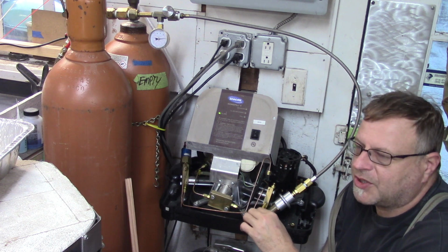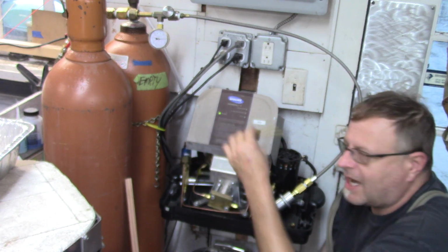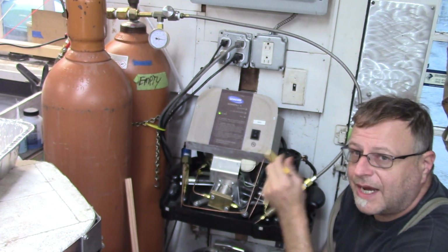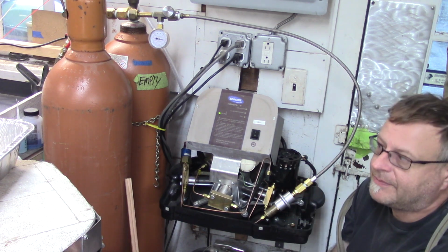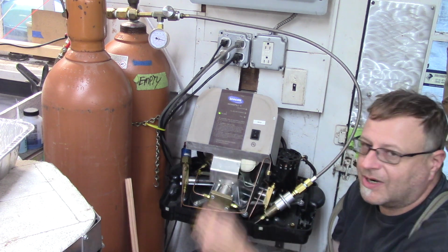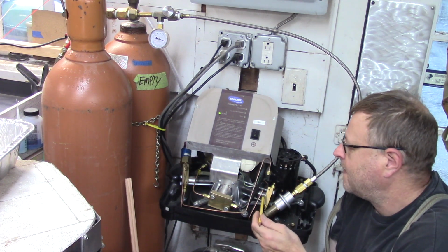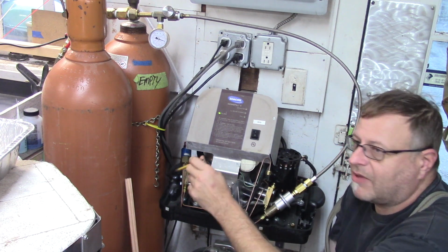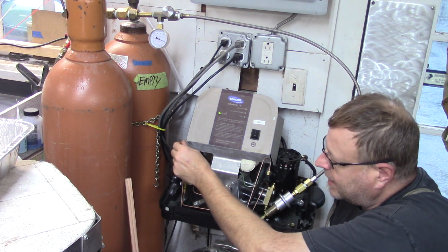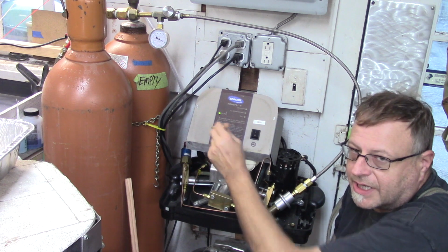I don't have a pressure gauge that goes up high enough without modifying one of my regulators to say what the psi coming out of each cylinder is. But what I can tell you is that when this machine reaches 1000 psi in this current configuration, it shuts off. So the hypothesis is that cylinder number 3 hits 1000 psi, goes from cylinder number 3 into cylinder number 4, and then from cylinder number 4 to cylinder number 5, it's then compressed to 2000 psi. When it reaches 2000 psi back pressure, the electric pressure release valve shuts off the electronic gizmos in the machine.